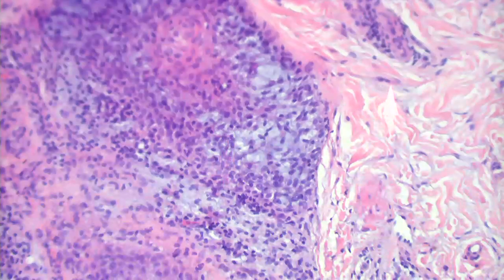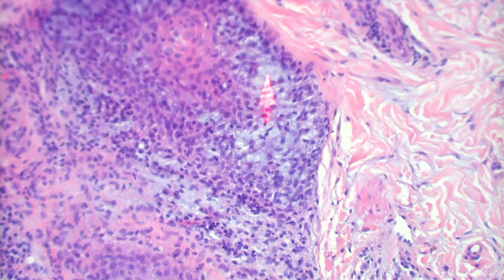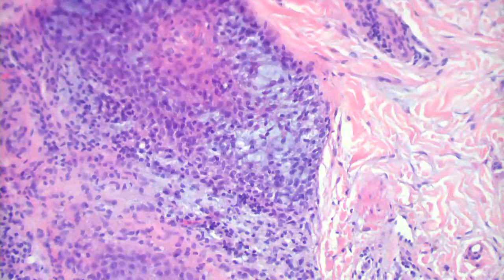So what is the difference between these two mucins? What is this one called? I'm not sure. Okay, anybody know? This is sialo or epithelial mucin. It's sort of analogous to the mucin that gets produced in your glandular epithelium, your GI tract, salivary glands. And this is hyaluronic acid. This is what we like to inject for wrinkles. You don't inject this for wrinkles. It looks the same, but it's a slightly different chemical compound. This is more acidic. It's got a lower pH than this does.